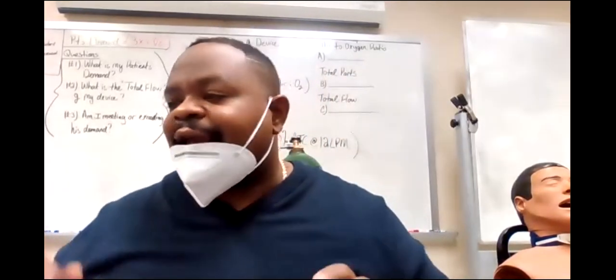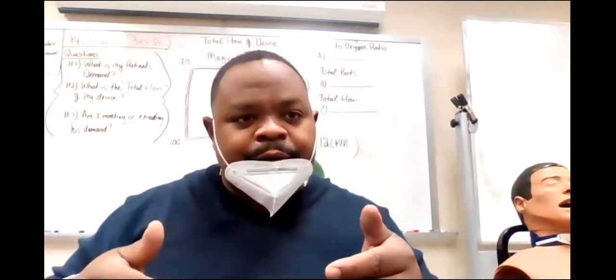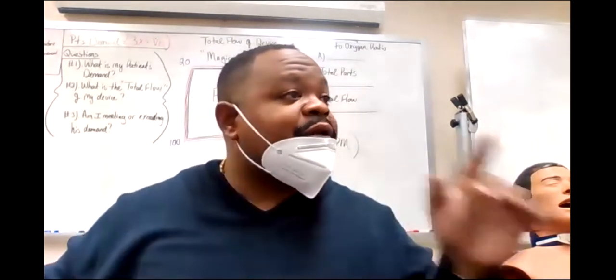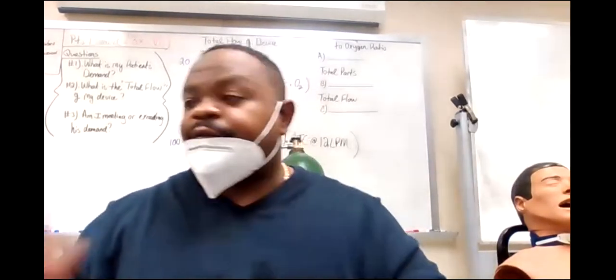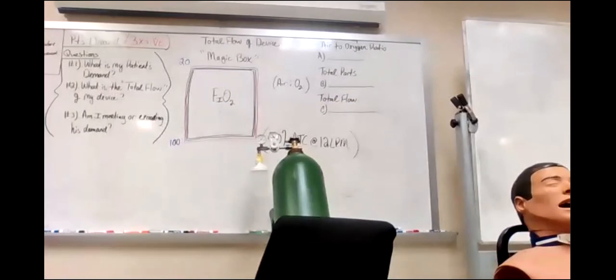All right, so let's look at the Venturi systems and how they entrain air to get the FiO2 that we desire. The first Venturi system is just a Venturi mask, which does not use water.